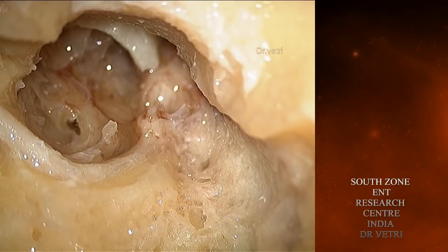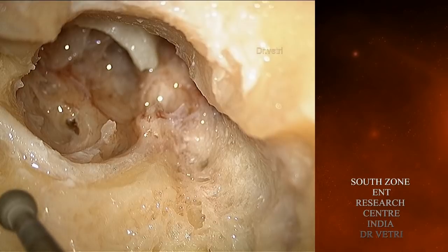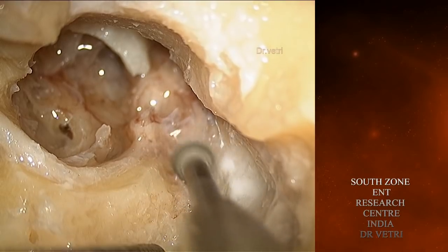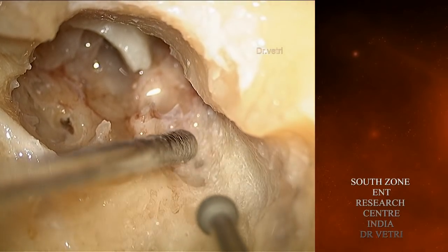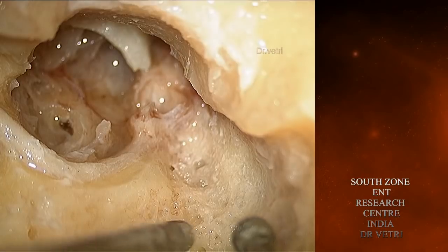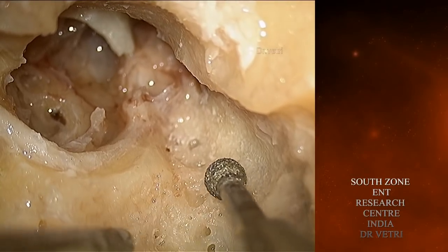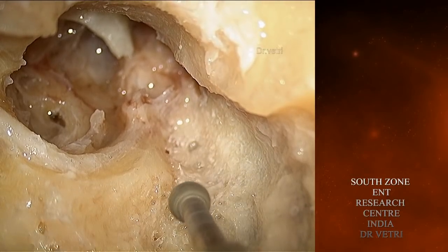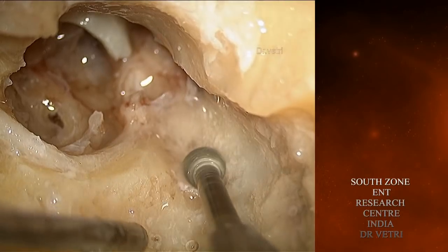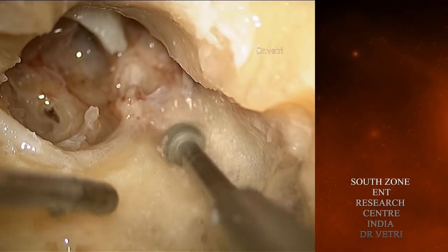You can see the beautiful dome of the lateral semicircular canal. The facial nerve lies antero-inferior to it. And the stapes lies antero-inferior to the facial nerve. The next step will be to drill all the accessible air cells around the labyrinth to delineate and carve the labyrinth.